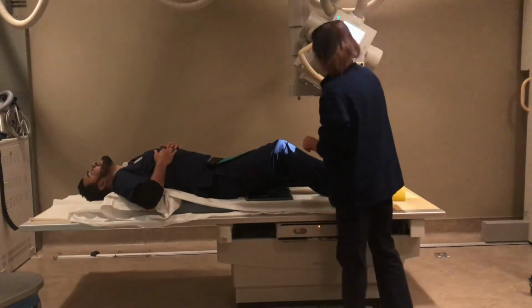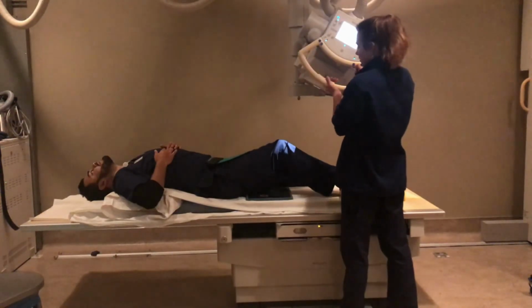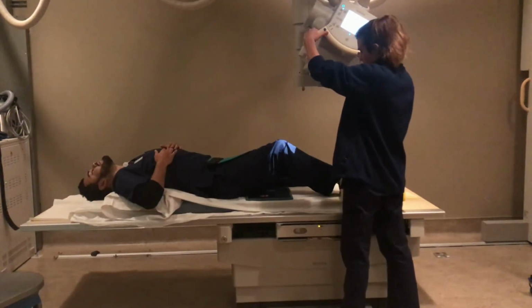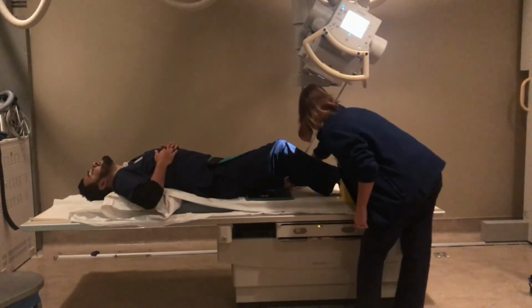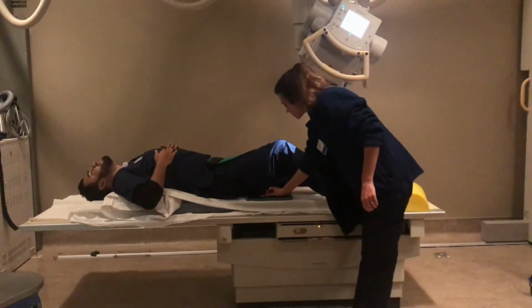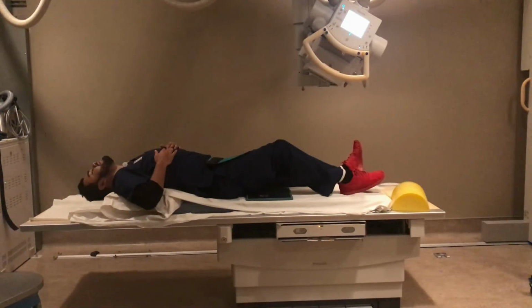I'll double check that. So 35, so I'll go back a little tiny bit more. Just like that. Okay. So Phil, go ahead and just stay still. I'm gonna go take that x-ray. X-ray, beep.